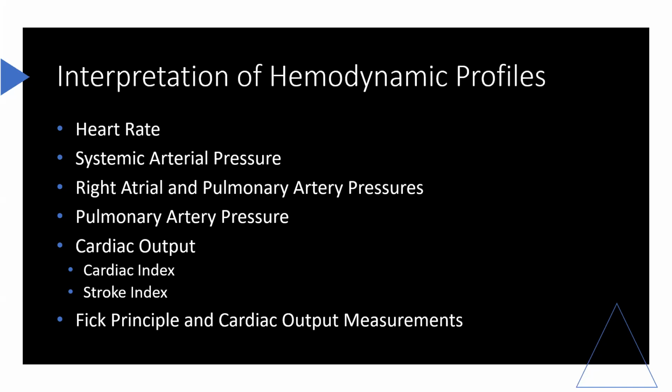The pulmonary artery occlusion pressure also plays an important role in assessment of pulmonary hydrostatic pressure in the formation of pulmonary edema. PAOP can help distinguish cardiogenic pulmonary edema, or increased pulmonary capillary hydrostatic pressure, from non-cardiogenic pulmonary edema, or normal pulmonary capillary hydrostatic pressure, as occurs in ARDS.